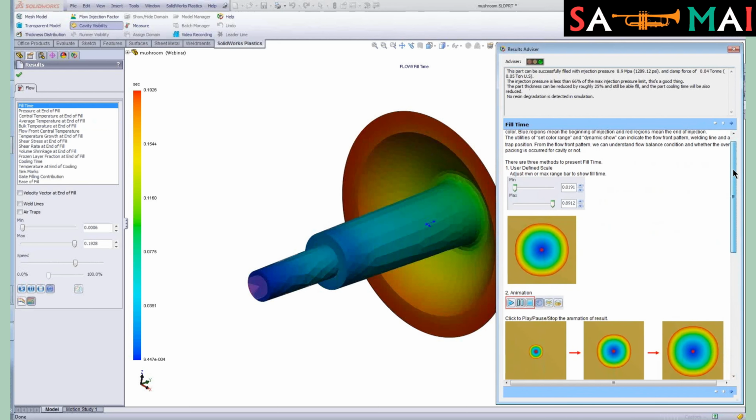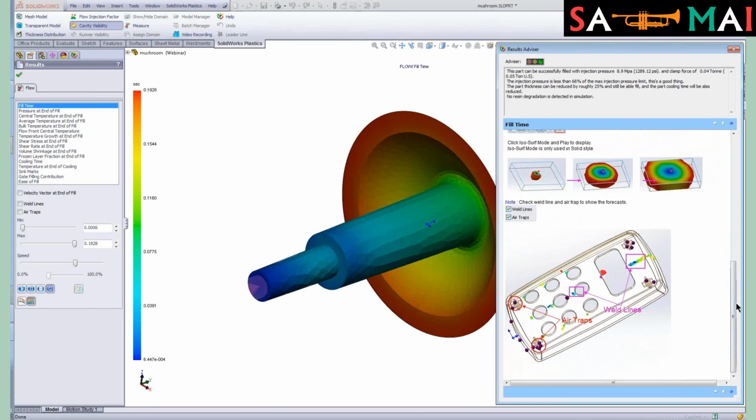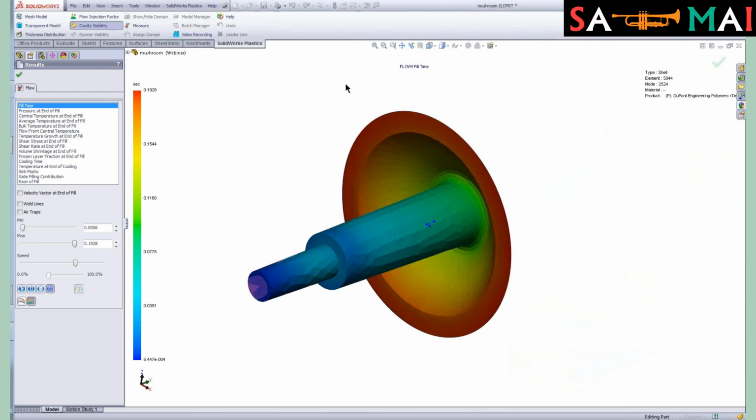So I could read down and see, fill time. What does that mean to me on this particular part? It's basically like a quick way to get into the help file. So I'm going to go ahead and close that, and let's start taking a look at some of the features that we have once we have our plot.